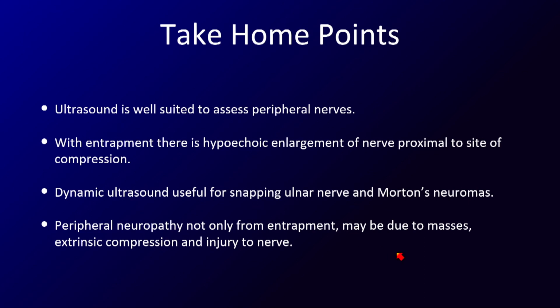But remember, if someone presents with the symptoms of a neuropathy and you don't see an entrapment, you may want to check whether there are any compressing structures or anatomic variants, or any masses involving the nerve, or injury to the nerve, even remote or from renegade shopping carts at Costco.